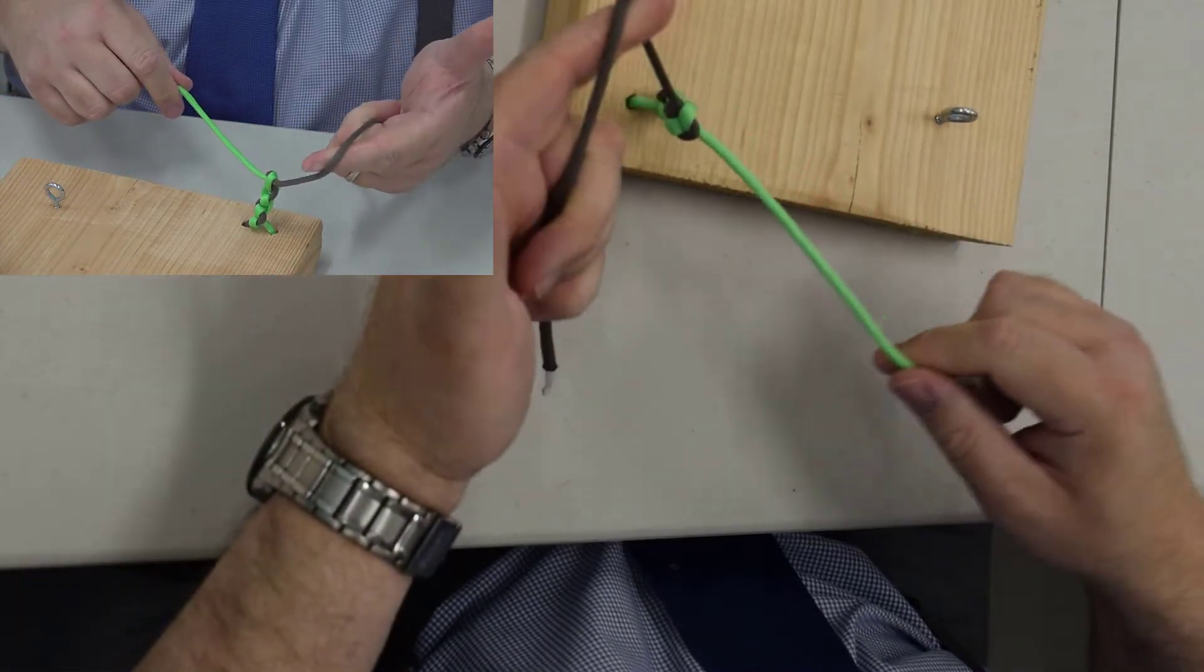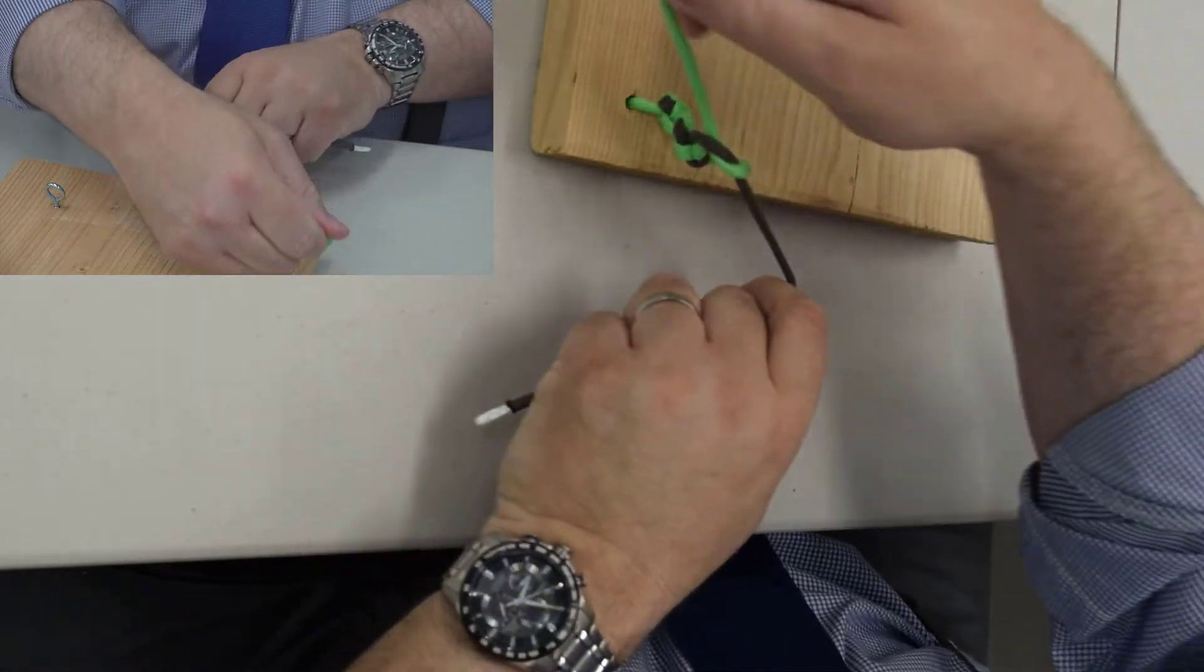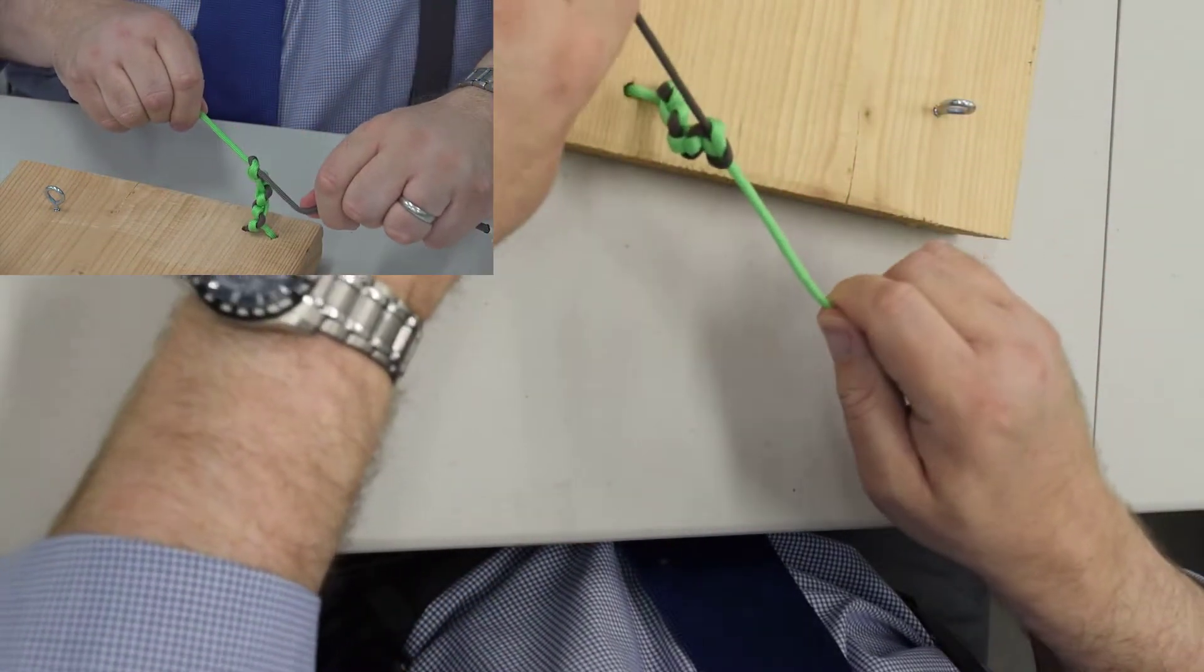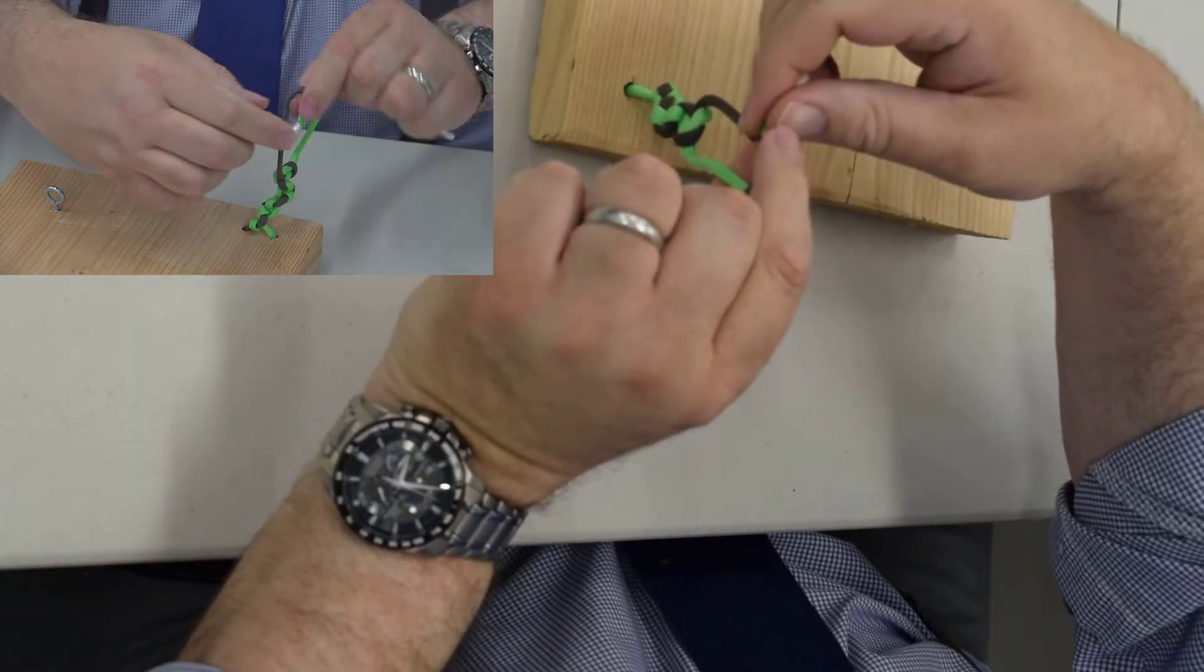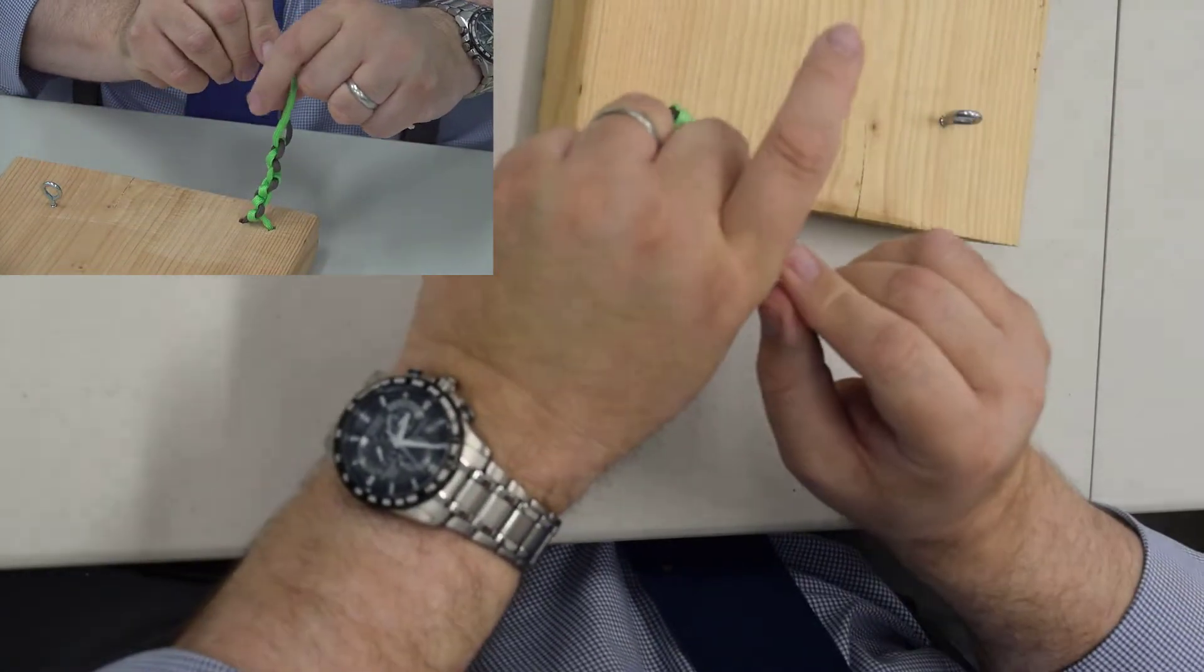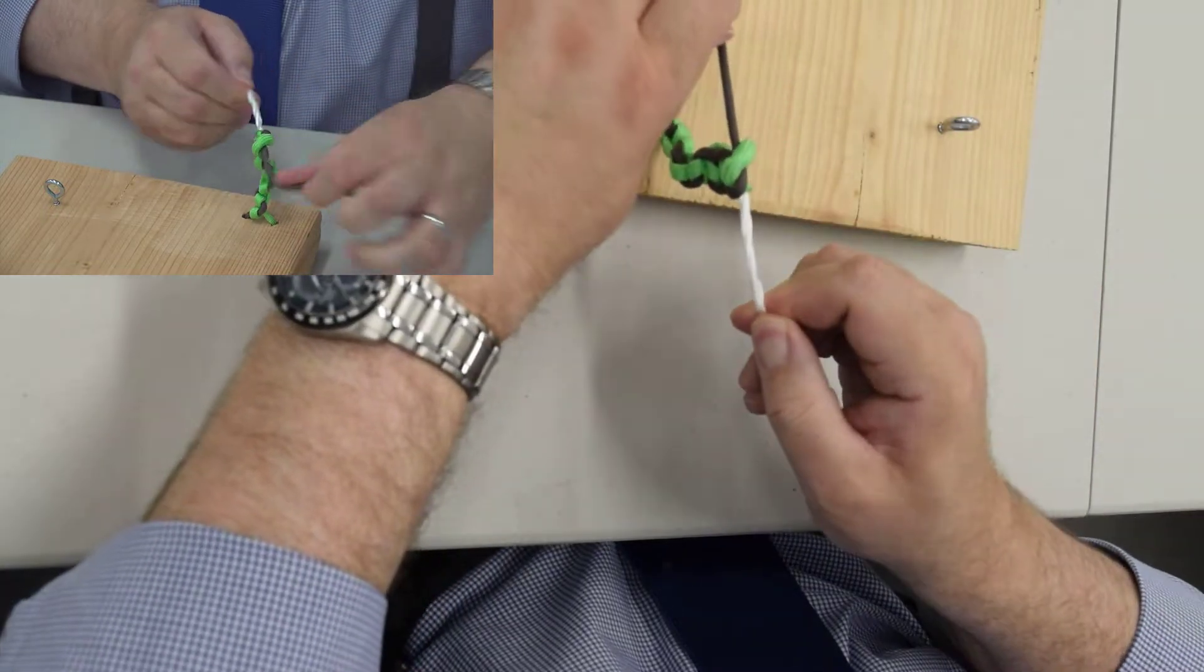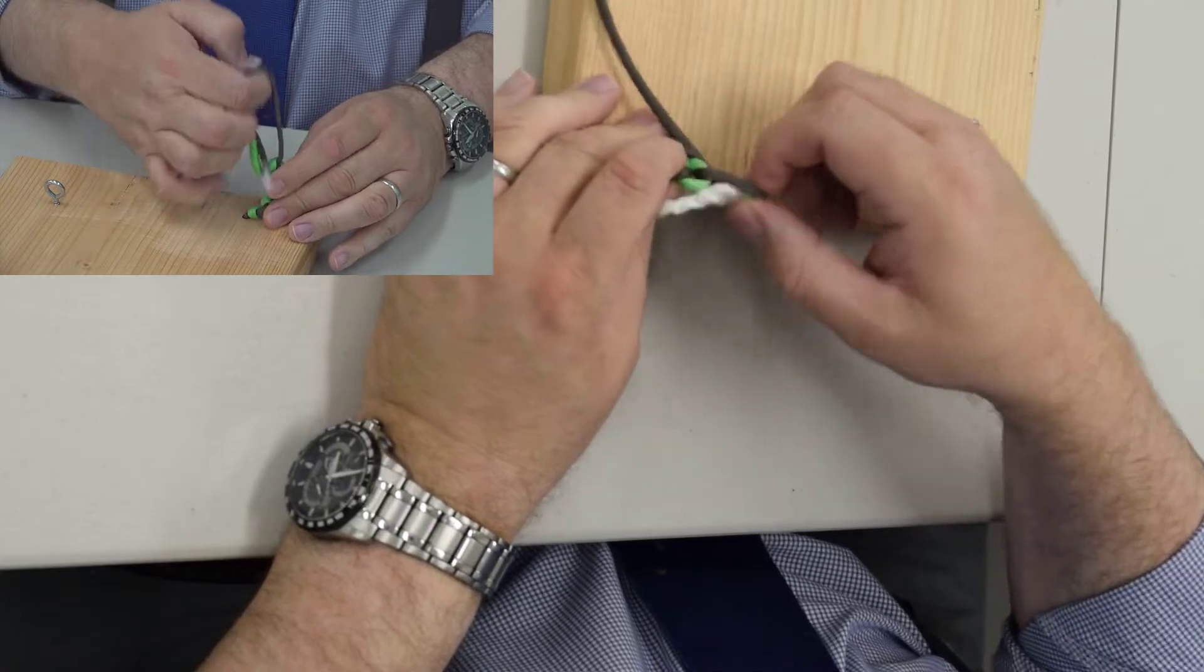So again, it's gun, gun, cross, and thumb. Gun, thumb. And yes, one of my strands is getting shorter than the other. That's to be expected. So that is a two-handed tie.